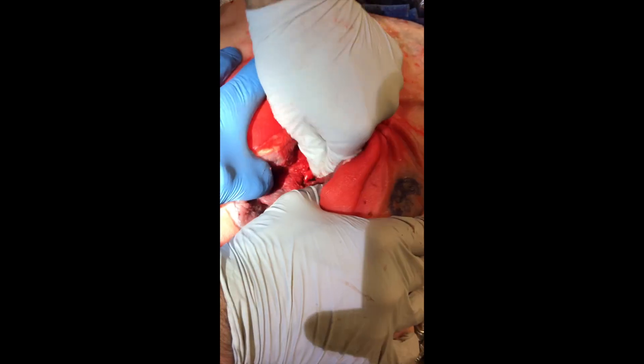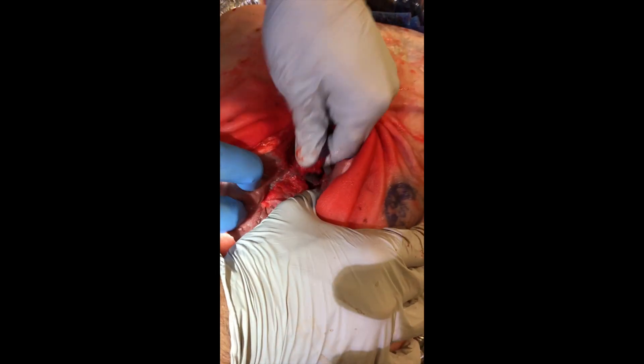What's that one right there? There's another one under. There's a bunch of them in there — they're all in there. They went down the tissue planes. That's actually awesome. There's a lot of them. There's one. There's a bunch of them underneath that.